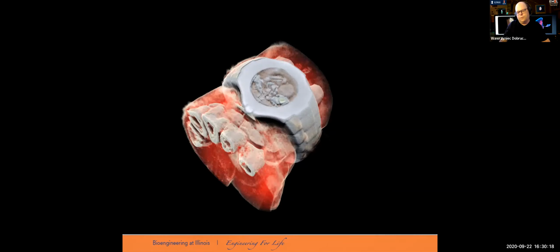This is another example from a patient who was wearing a wristwatch. You can observe that this is a metallic surface, so it will be highly attenuating. In a regular CT scan, it will create a lot of artifacts, so-called star artifacts, because of the very high attenuation of the metallic pieces. But using this system, it's completely fine to image metallic parts together with the bones and the tissues. So I think these are all the images that I have.